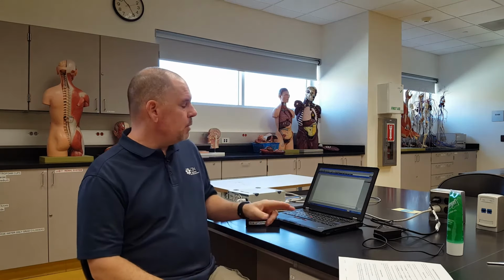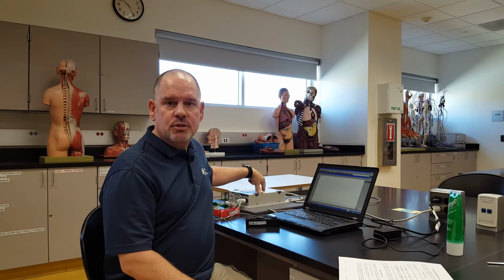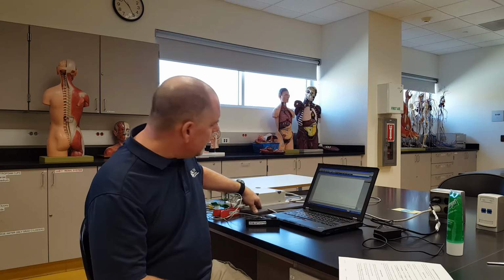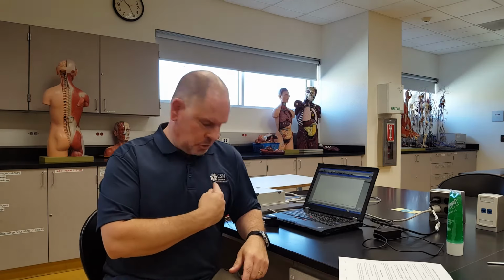What you see in front of me is a simple laptop computer and what's called a PowerLab box that actually generates our electrocardiogram. You probably can't see, but I have a foam rubber pad and an actual rubber pad under this box to electrically isolate it. It's sort of tough once in a while in this room with all the electrical interference to get a good ECG, but I'll give it the old college try and see what we can produce. Your job for lab number 1 is to know the parts of an ECG waveform, what causes each, and how to calculate heart rate from an ECG.